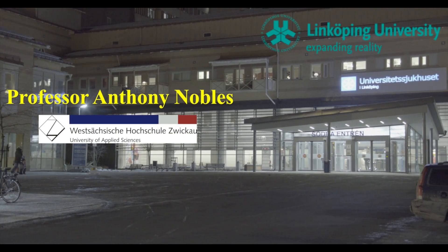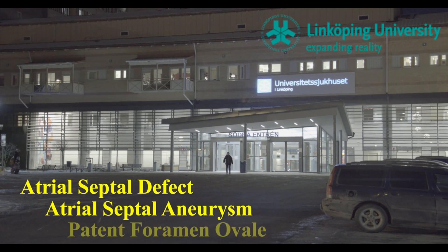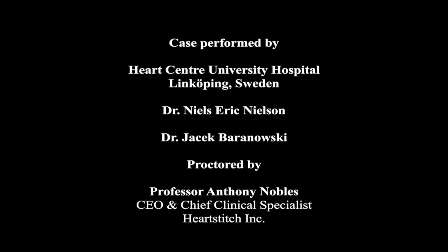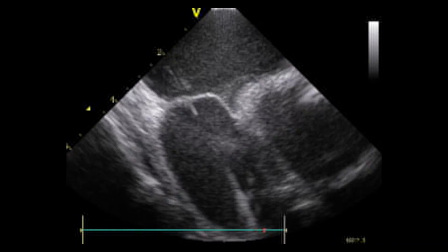This presentation is the first in man use of the Noble Stitch EL for closure of an atrial septal defect, an atrial septal aneurysm repair, and a patent foramen ovale closure, all performed in a single patient. The case was performed by Dr. Niels Eric Nielson, assisted by Jacek Baranowski and Professor Anthony Nobles.